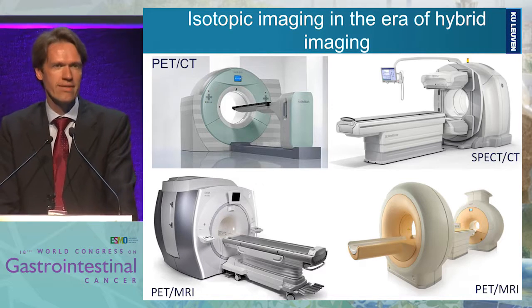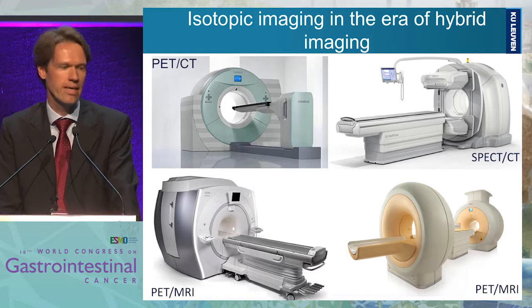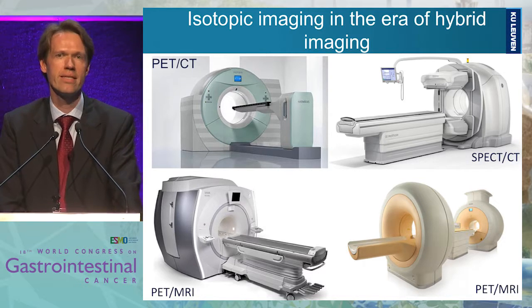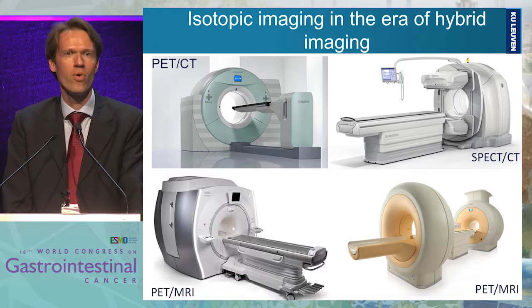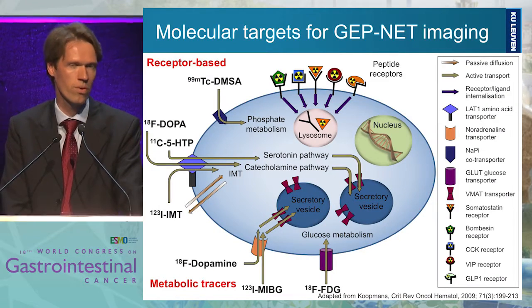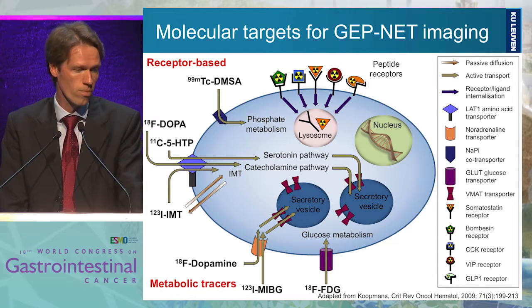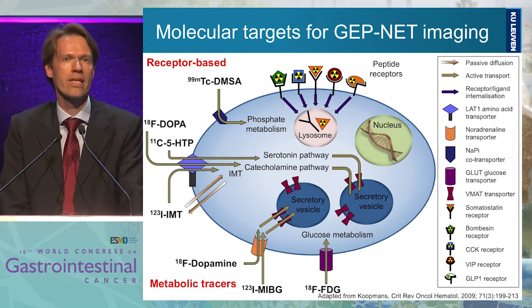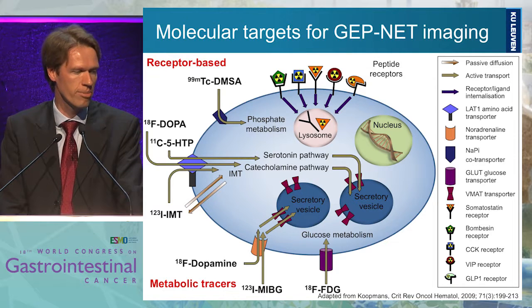It's very important to realize that in 2016, nuclear medicine is by definition now a hybrid imaging specialization. We've had PET CTs for a long time, and in more recent years, we've had SPECT CTs, and now more recently PET MRs at our disposition. And the role of the nuclear medicine physician is to highlight molecular targets on top of the morphological images.